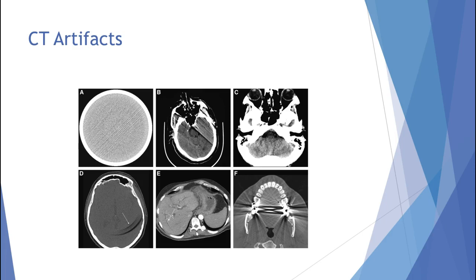Okay. B is the streak artifact that's caused by bone into the skull imaging. Okay, C, I don't really see any artifact here. This is what bone looks like. It does have the algorithm on it for bone though, okay?